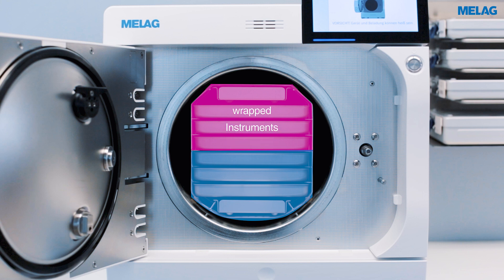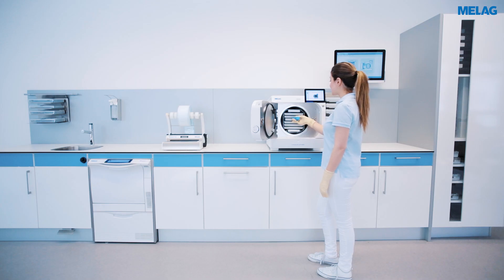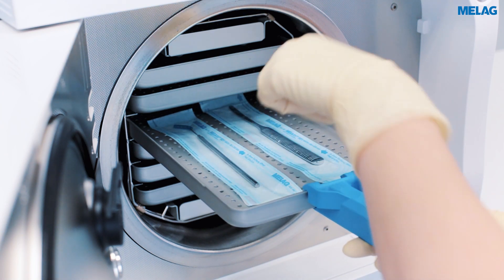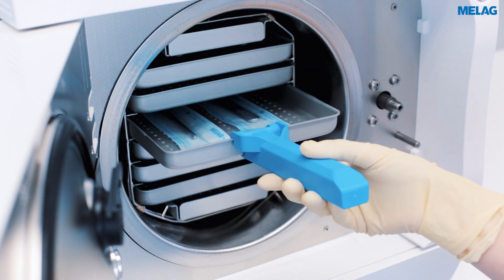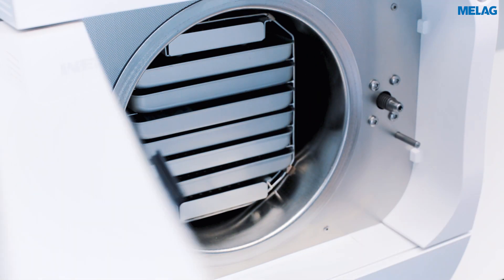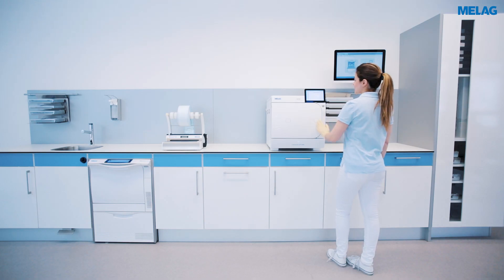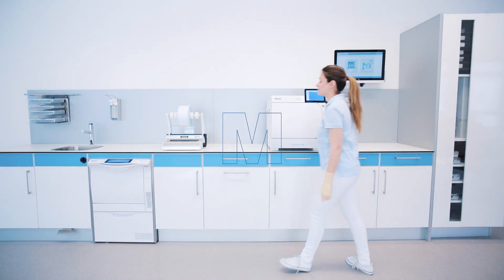Instruments in transparent sterilisation packaging should be sterilised as far up as possible. The heaviest loading elements and unwrapped sterilisation items are placed below. The perforated Milag trays ensure that the condensate drains off in an ideal way; for this reason, please refrain from using tray inserts made of paper. Further information on loading the Carebox and Careclave can be found in our user manual.